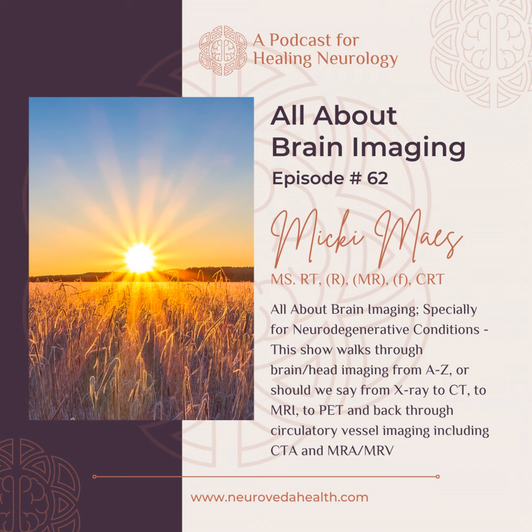Do you know why cancer lights up with gadolinium? Yeah, because MRI is using magnetism and radio frequency waves. The radio waves are basically sent in to tip over the hydrogen atoms in the body. And as that happens, the magnet will align all those atoms to the frequency of the coil, if that makes sense.